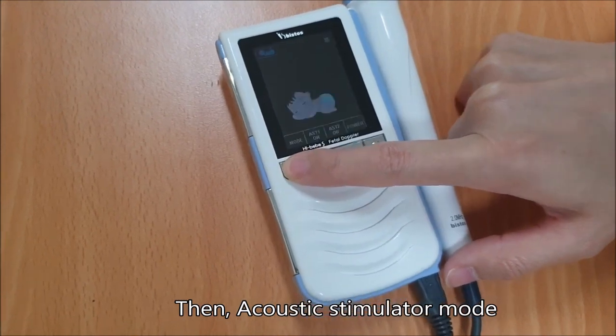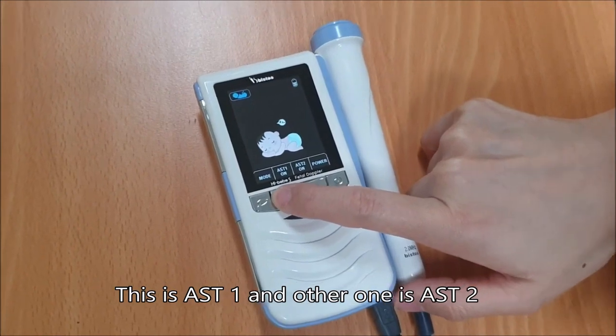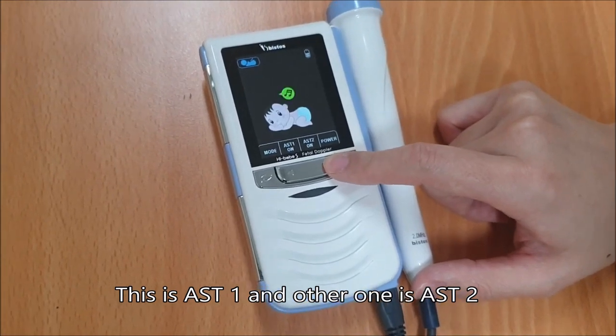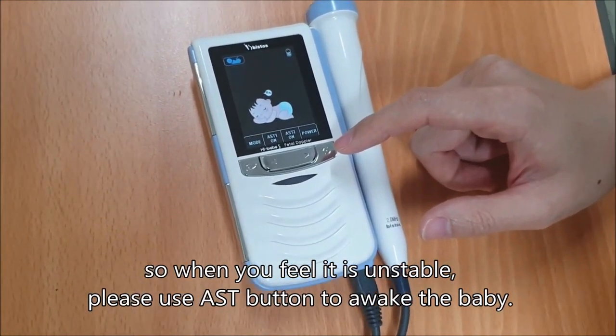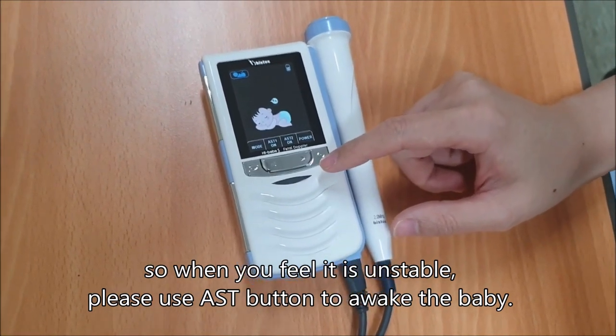Then, acoustic stimulator mode. This is AST-1, and the other one is AST-2. If the baby sleeps, the fetal heart rate could not be accurate. So when you feel it's unstable, please use the AST button to awake the baby.